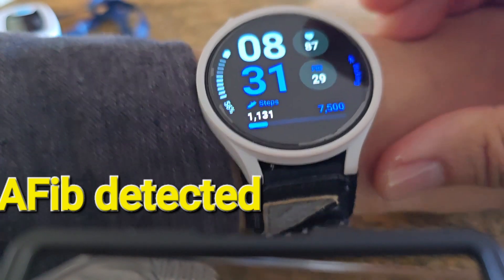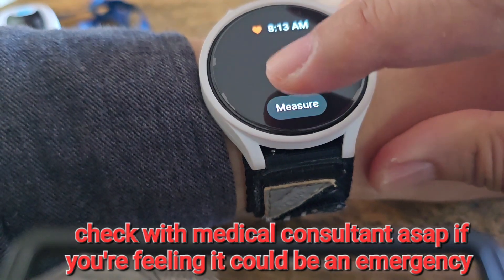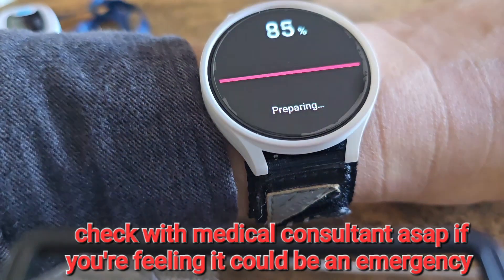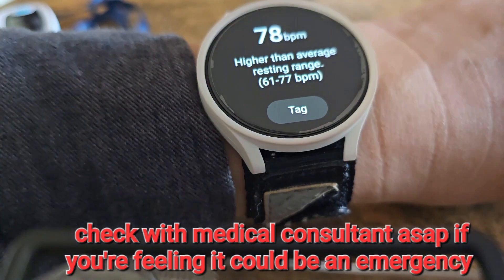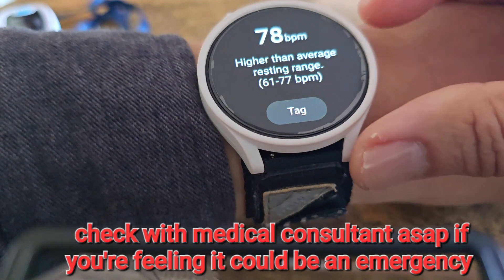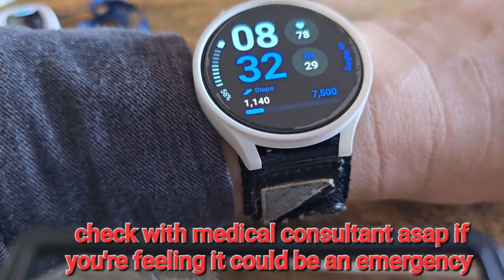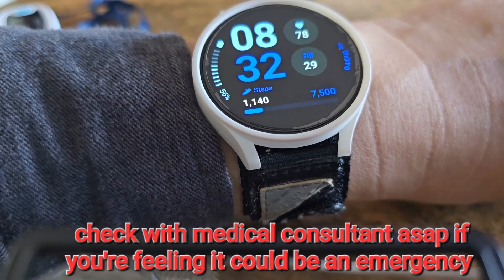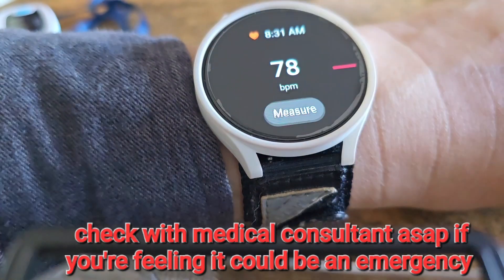Every 10 minutes it'll check my heart rate. You can set it to every second or every minute. You can see how fast it's checking right now — it's going pretty fast. My heart rate is never 78; my average resting heart rate is in the 50s, sometimes low 60s.